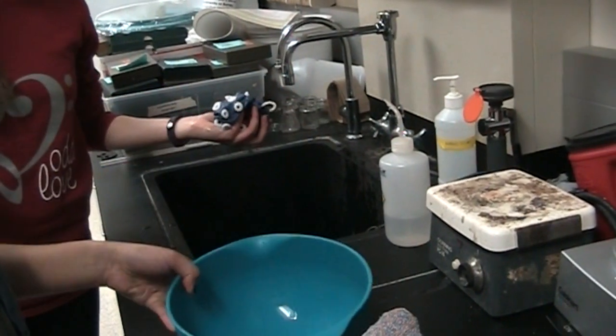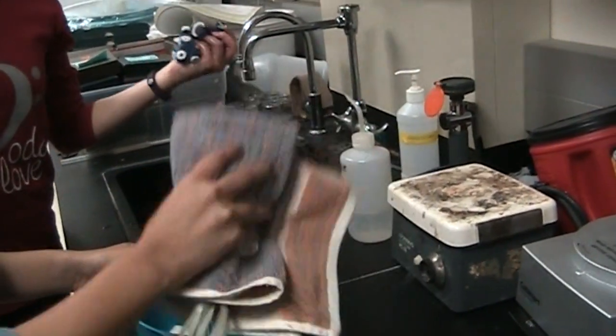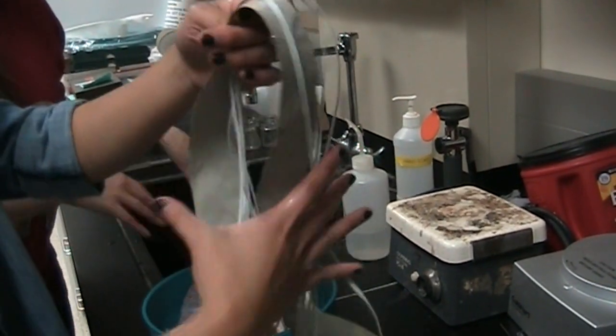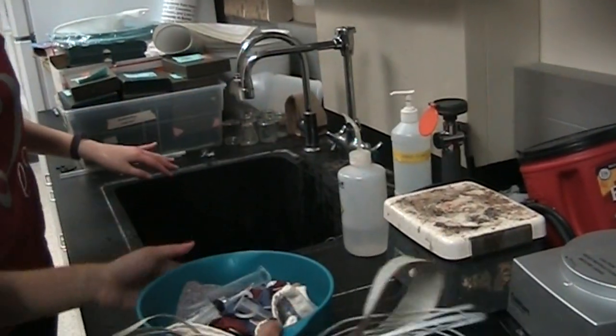And the reason that we take the towel in the prep room is in part because the electrodes are not supposed to touch any metal. As you can see, there's lots of metal in this room. So that just ensures that we're not damaging the electrodes.